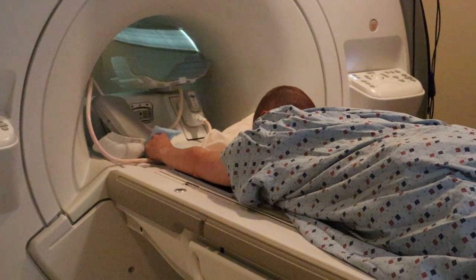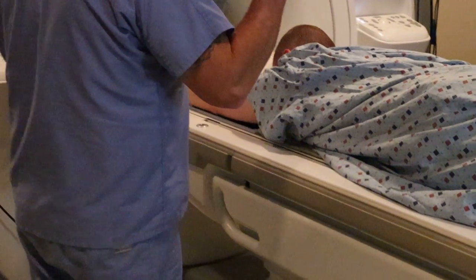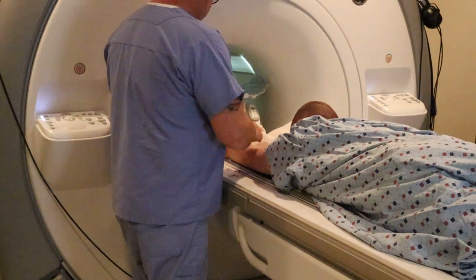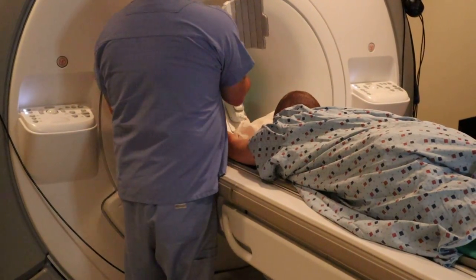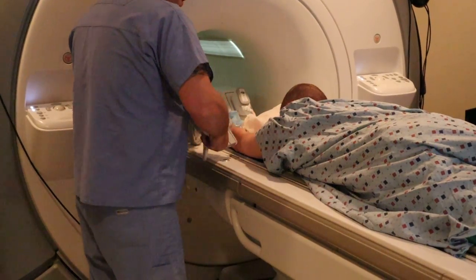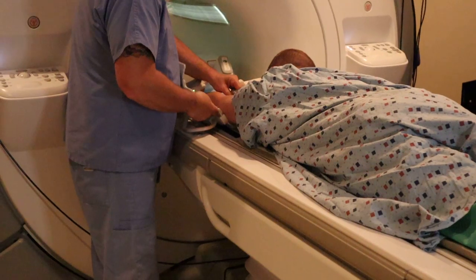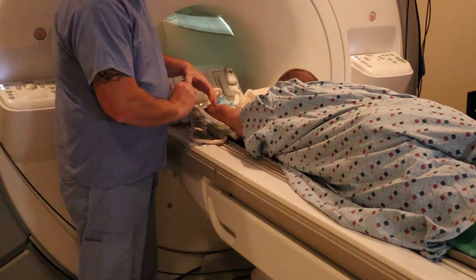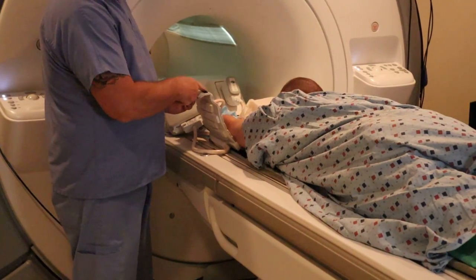Notice how his arm is nice and flat and in plane. At this point you'd want to have the palmar side up on the elbow and make sure that the humerus and forearm remain in the same plane. You want that palm face up to open up the elbow joint.